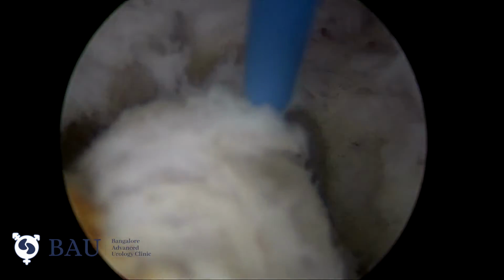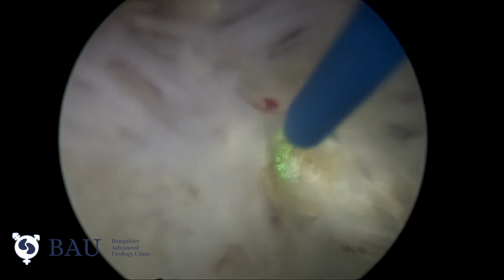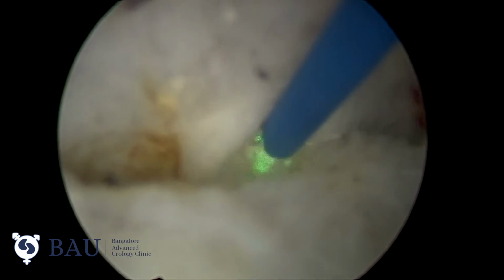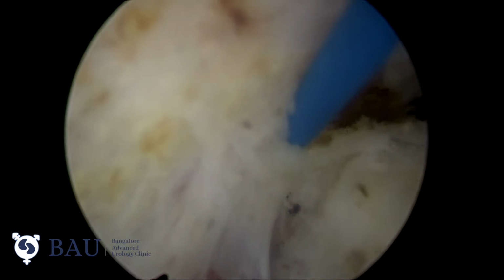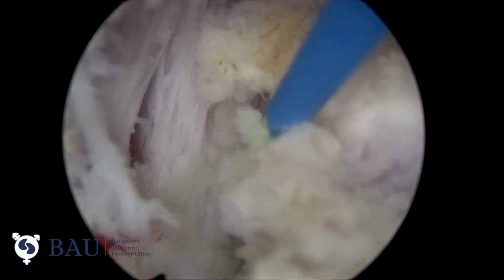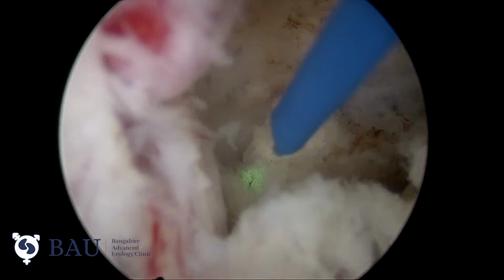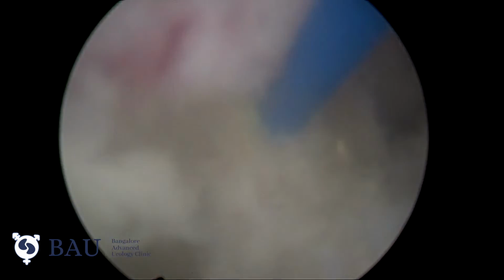Sometimes anterior dissection becomes difficult. So in that scenario, keep dissecting on the lateral plane, and once we come to the anterior plane, we have to move the scope a little bit distally and identify the apical region properly where we have dissected early, and cut the connection between the prostate lobe and the capsule. That way we can enter the plane easily.